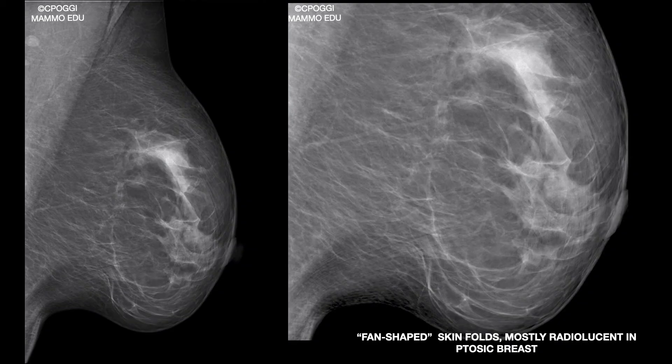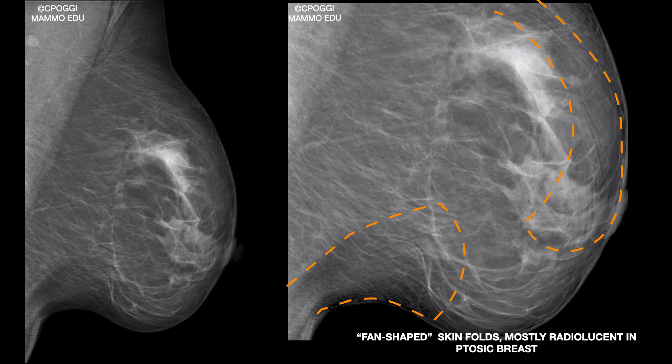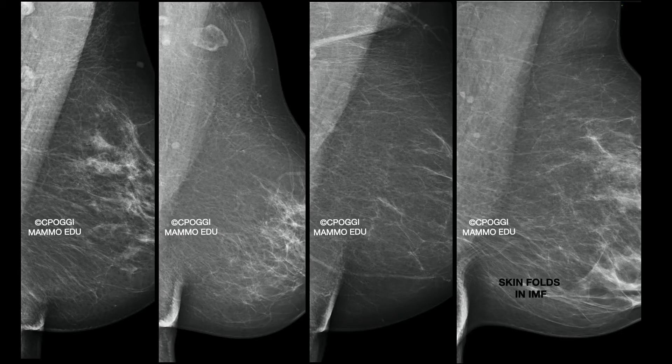This is a fan-shaped artifact made of multiple skin folds correlated to severe ptosis of the breast. They are very difficult to remove and are usually found in women who have lost a lot of weight. Another very common skin fold is in the IMF — it can be more or less thick, long, or dense.